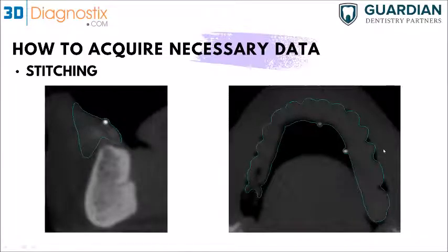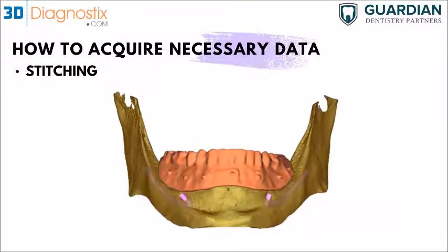And once we've got everything set, here is the final outcome. So once we're done stitching, you can actually see the patient's denture right now. You can see the flanges, and you can use those dentition on that denture. So you can use them for planning, basically.